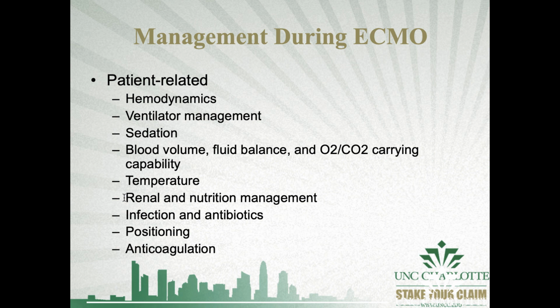You can also look at what's called an anti-10A, which is a serum level that represents heparin binding and inhibiting effects of heparin on activated factor 10. So I often use APTT, or your HepCon, or your anti-10A. That's generally what I use to titrate my heparin.